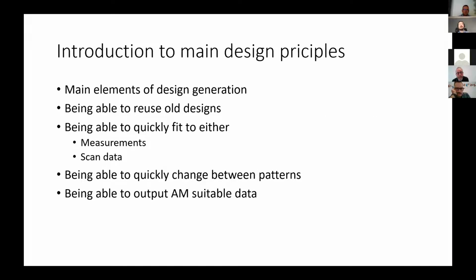So based on this, we developed the main principle here of the software, that we should be able to reuse designs, want to be able to quickly fit to either measurements or scan data. In those cases, this exists. And being able to change quickly between different patterns that we'll come to later. And of course, being able to output AM suitable data for producing the part in the end.